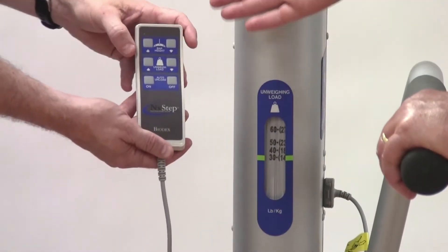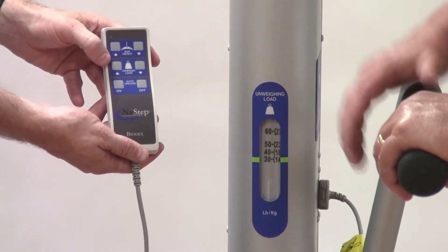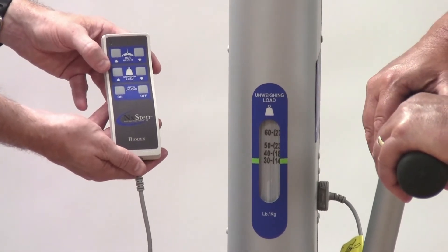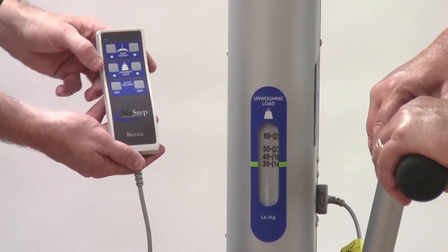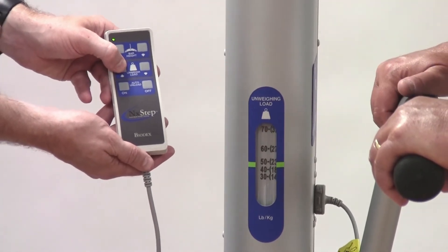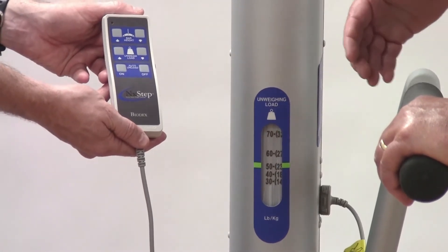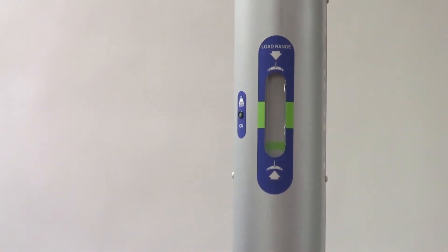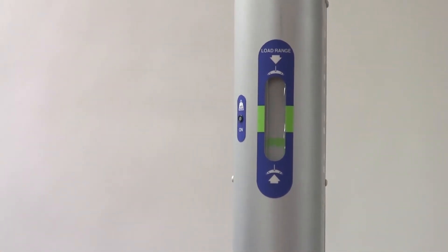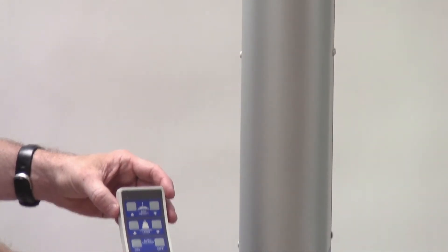Dave is going to select the unweighing load. Let's say you want to go to about 25% of body weight, so Dave is going to go to 50 pounds. He's going to move the unweighing load — now he's taking 50 pounds off of me — and then he's going to raise the bar into the green zone. Once in the green zone, I have 50 pounds off of me.